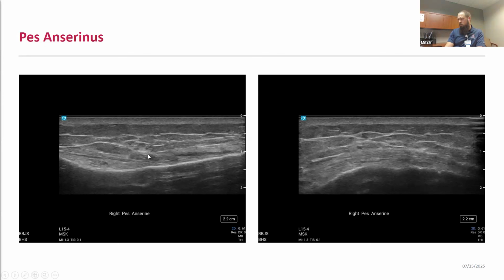And so here we're again in the long axis view, and we start to see these tendons coming across the deeper tibial collateral ligament. And this is going to be the area where you're looking for any bursal fluid. Typically, you're not going to see any evidence of fluid in these cases. Rarely do we see true bursal inflammation in these areas, but if it is present, you'll typically see it between the Pes Anserinus and the underlying tibial collateral ligament.